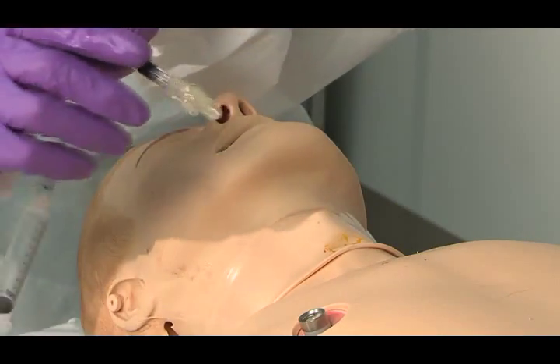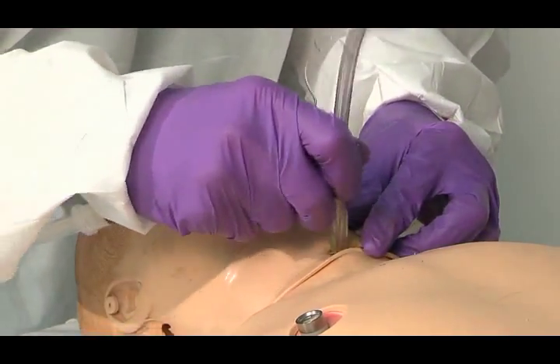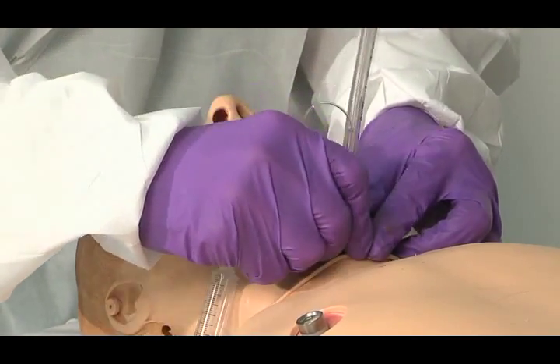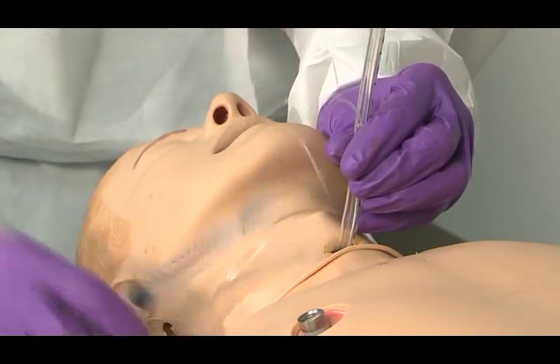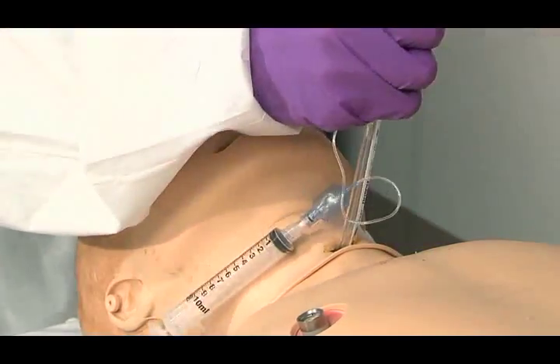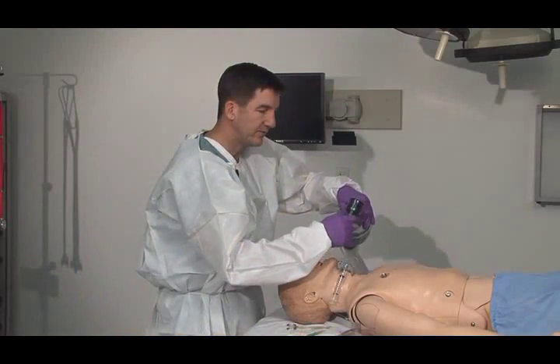Your tube is already set, ready to go — placed in just past the cuff. You don't need to put it in as much as you normally would. Inflate your cuff and begin ventilating.